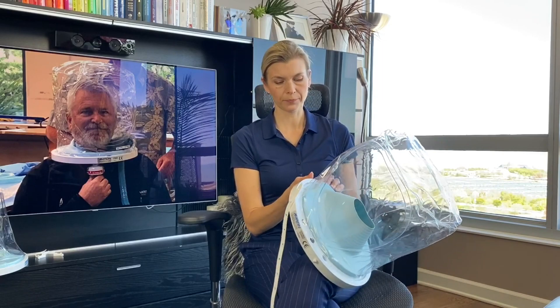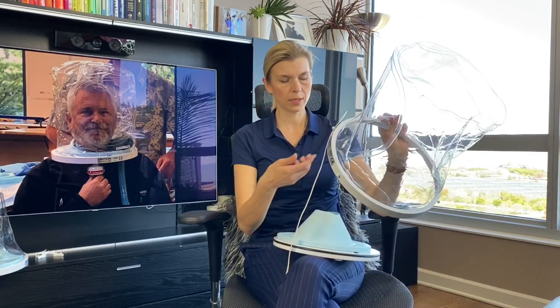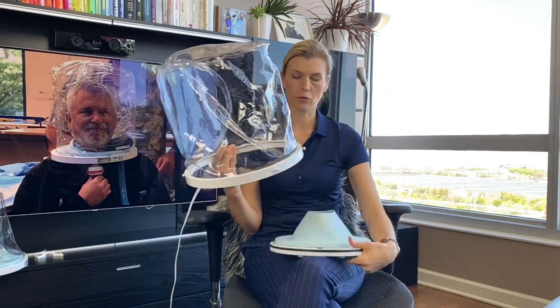So this helmet is a two-piece helmet. It comes with the neck seal already attached to the bottom ring, with the underarm straps, and the top coat. I will talk about the bottom piece first.